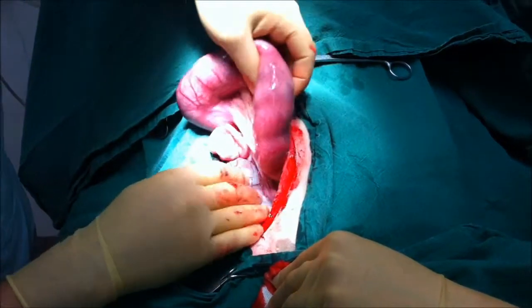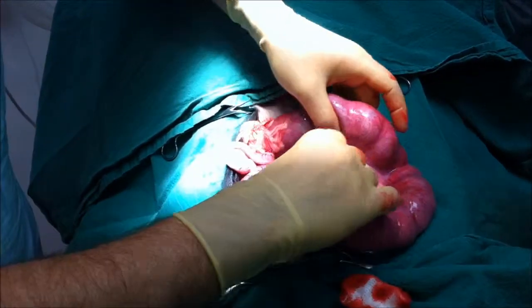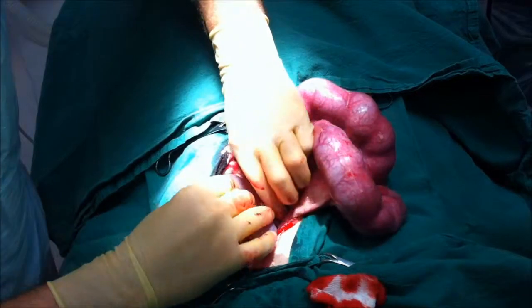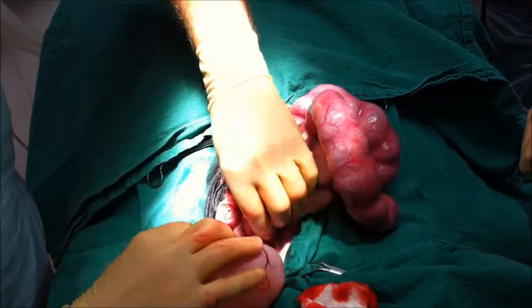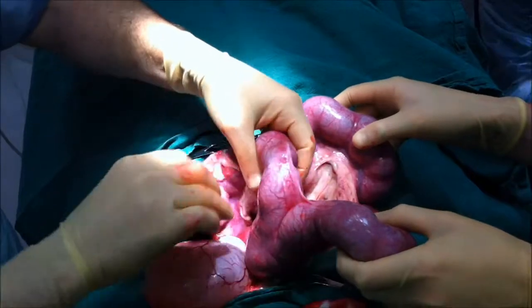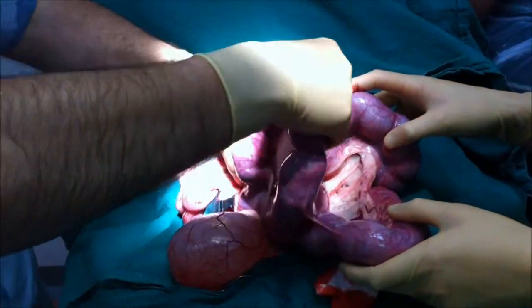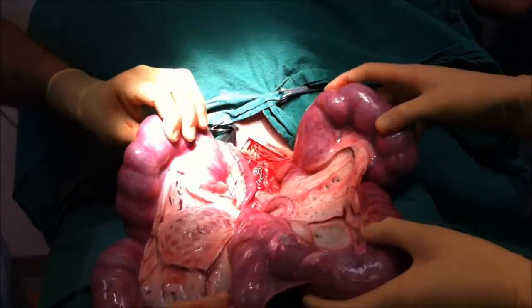The uterus is very long in a bitch. That's it all there — so that's one side of the uterus, and here's the other side coming out now. And there we've got the full extent of the infected uterus.